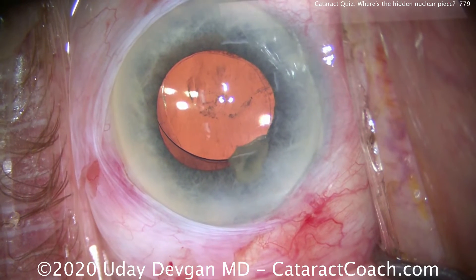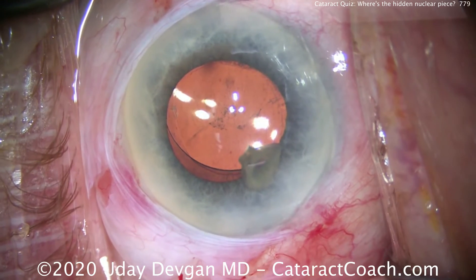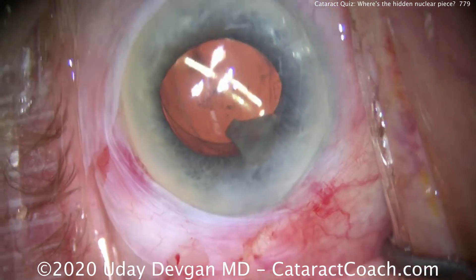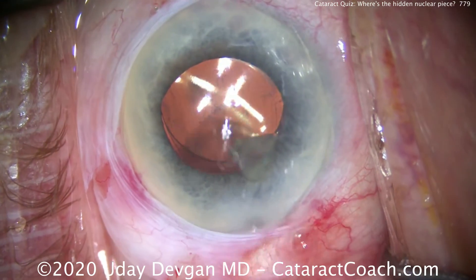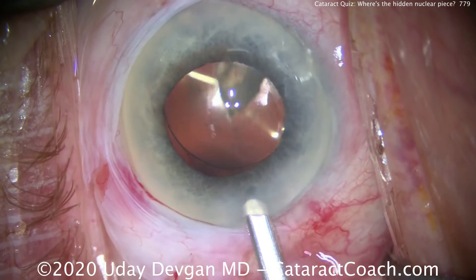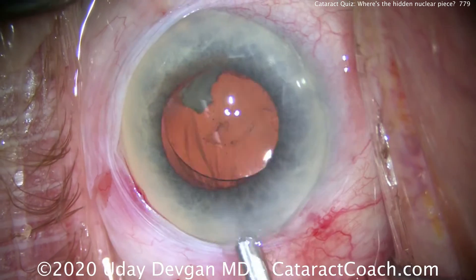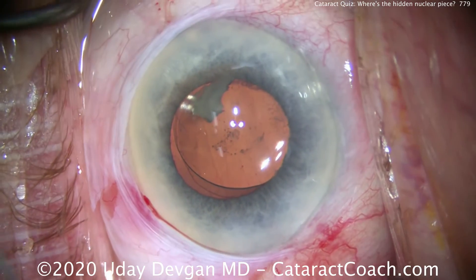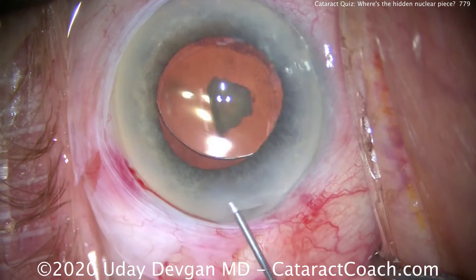So we'll leave it in the eye, and I'll have our technician switch back to the phaco probe — as crazy as it sounds. She's looking at me like, why do you want the phaco probe? And I said, look at the monitor. She says, oh, that's a surprise piece. We could try to aspirate, wash, or flush it out, but it's a relatively large piece and it's not going to come out that easily.